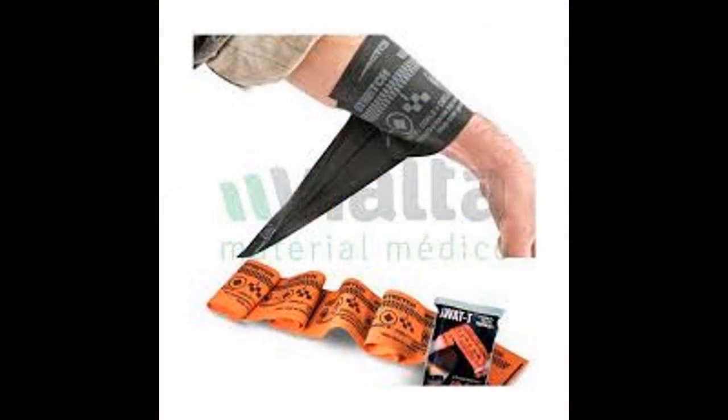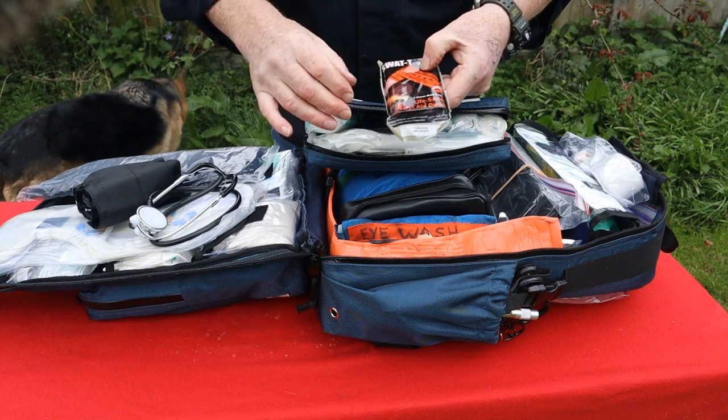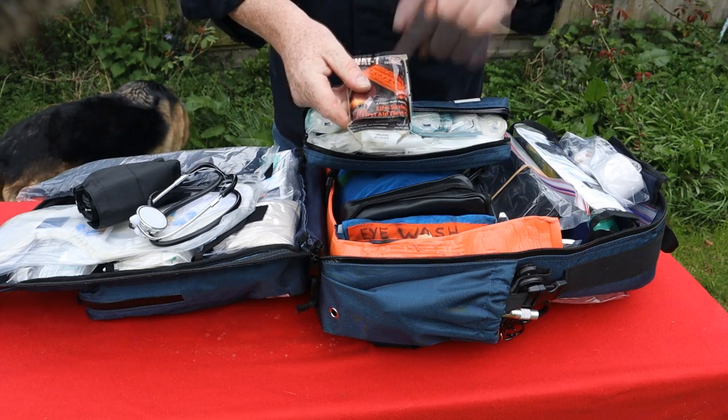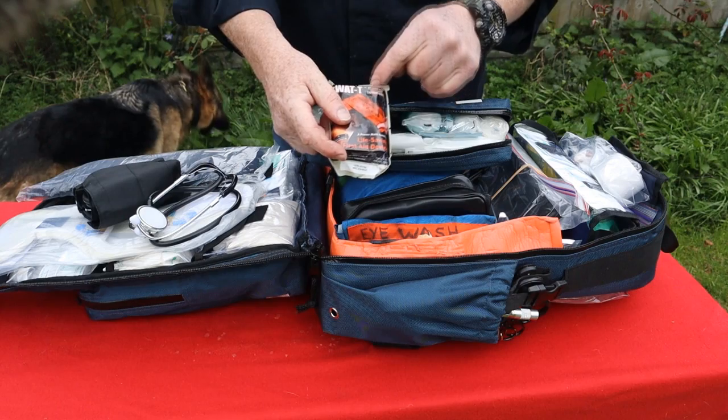This is a really funky little gadget. It's called a SWAT-T. Very simply, it's a 4-inch wide long rubber band. This one's bright orange. I'll drop some pictures in for you as to what it is and how it's used. I like this over a run-of-the-mill tourniquet because this can be used as a pressure dressing.